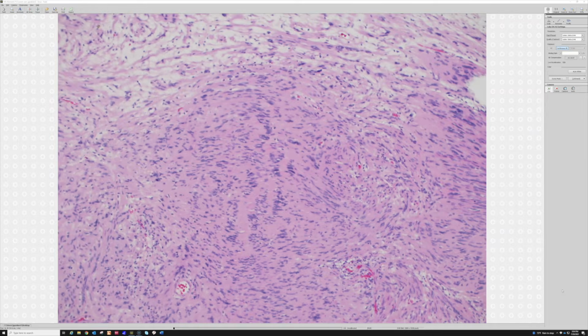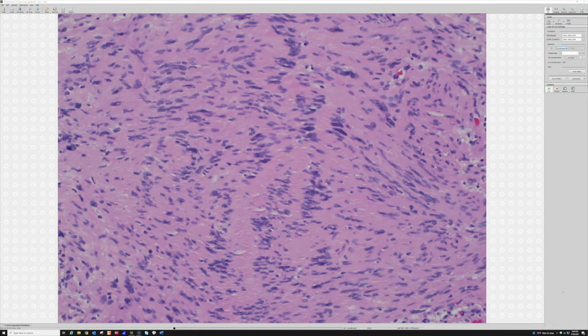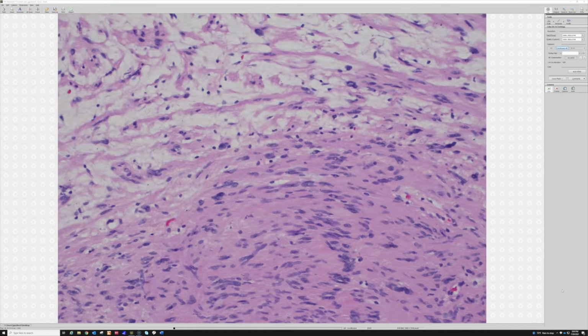I mean, that's what the textbook shows, because everyone wants to see that, right? Because it's pretty and it's really easy to recognize, and even med students, we teach them. But when you don't have that, if you don't know those other subtle features of schwannoma, you can be in trouble. And I did say if it looks Schwannian, well, cytologically, there are a couple clues to Schwann cells. Let me see if I can find some here.